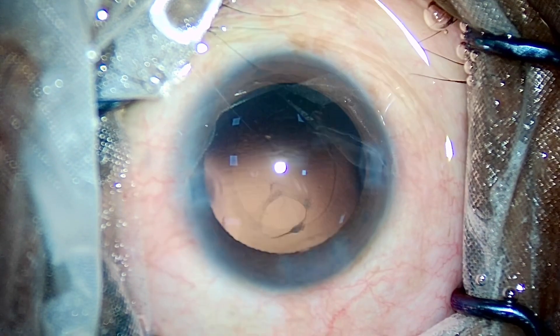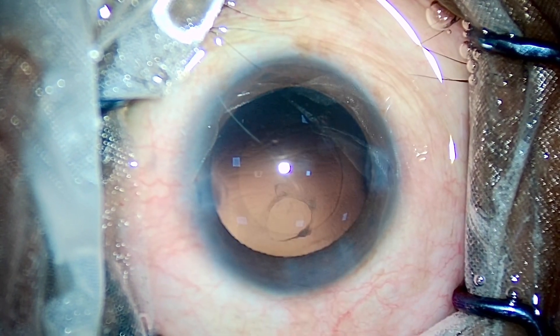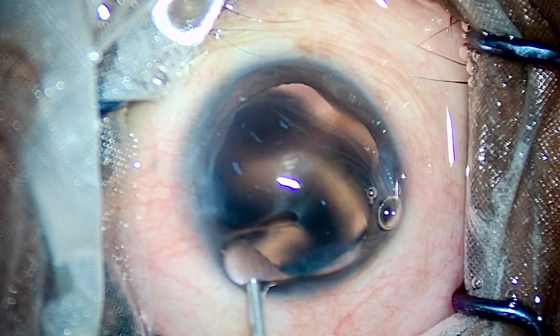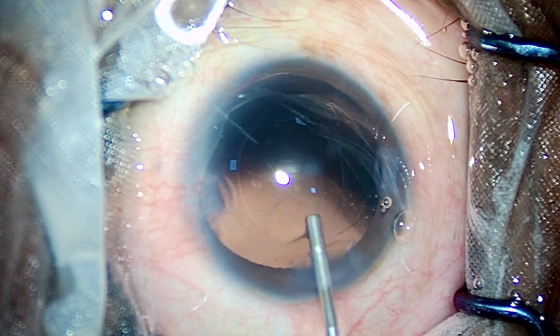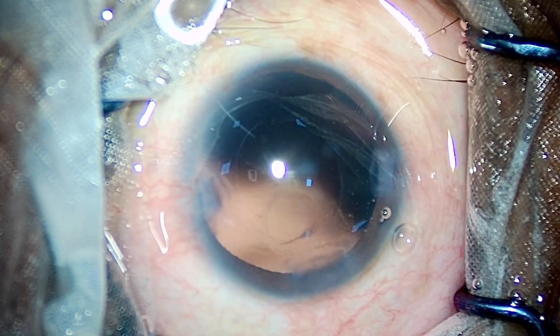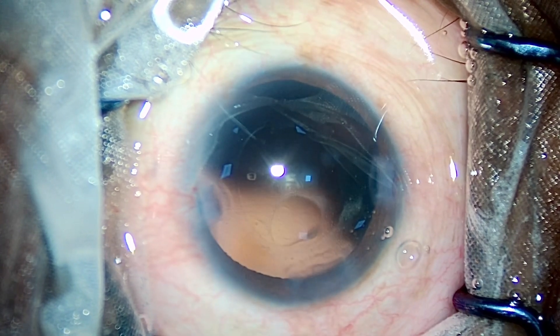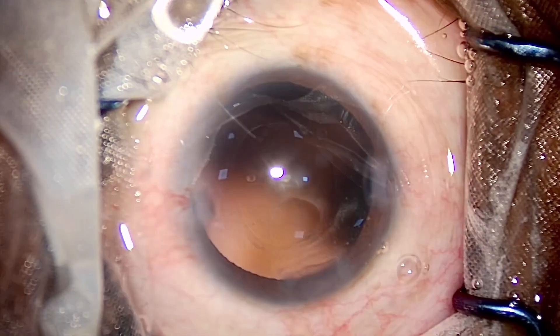Right here — what do you see? I've been misleading you all till now. For those who don't know what this is: this is NOT a posterior capsular rupture. This is not a PCR. This is just a Weiss ring from posterior vitreous detachment.